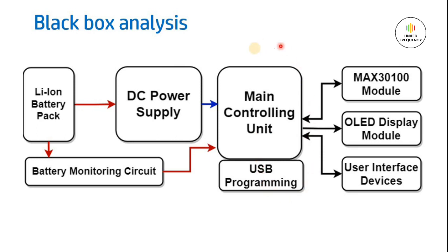Thereafter, we will have one main controlling unit, also called the MCU for short, which will control all the peripherals as per the requirement, and all the algorithms or program have to be run on this level. We will have a USB programming circuit inside this main controller development board so that we need not bring up any circuit which converts the USB data into microcontroller programmable data.